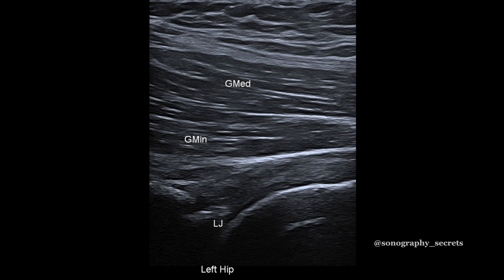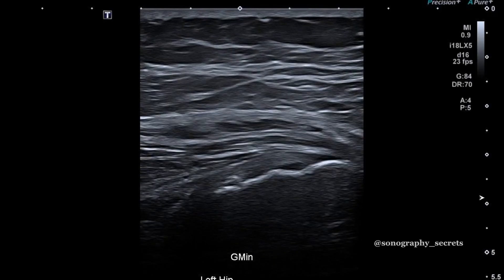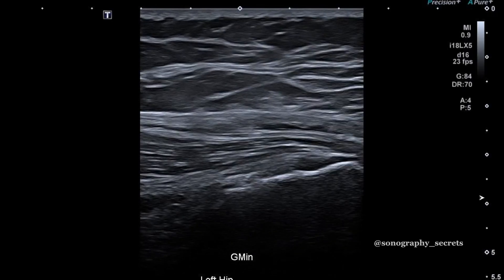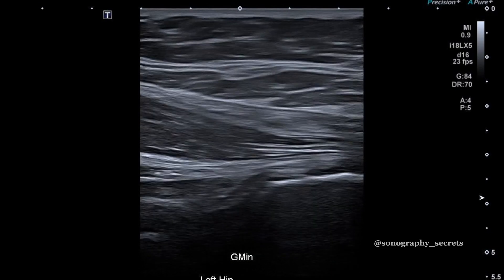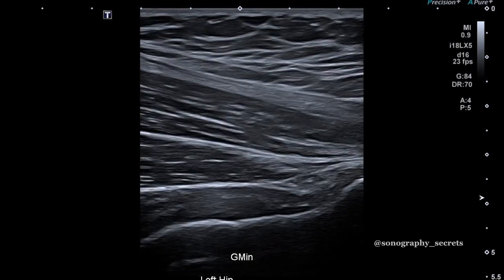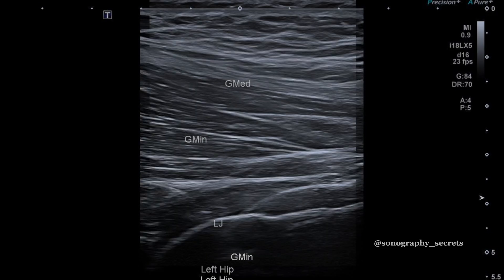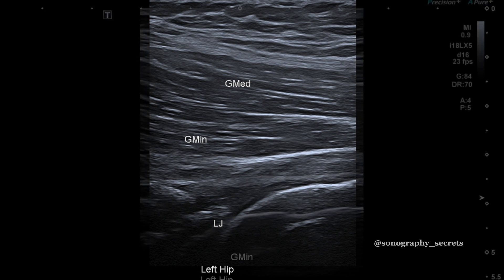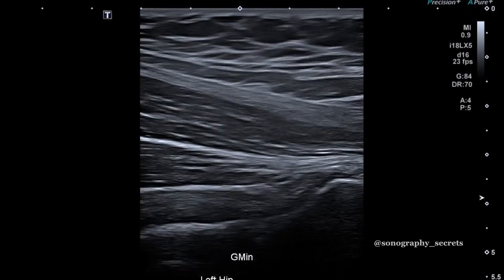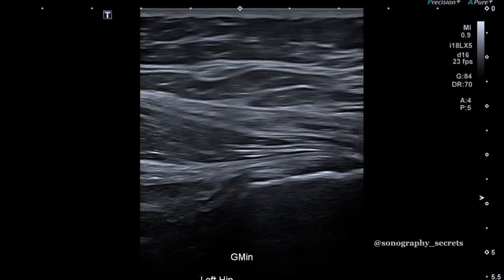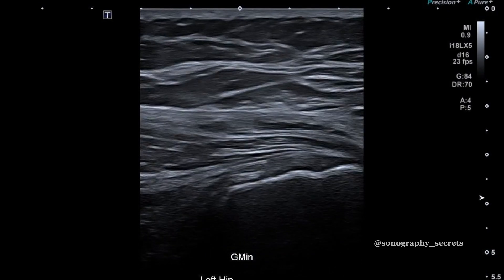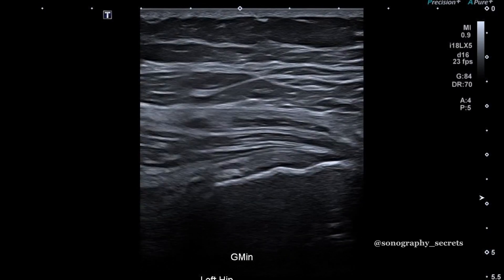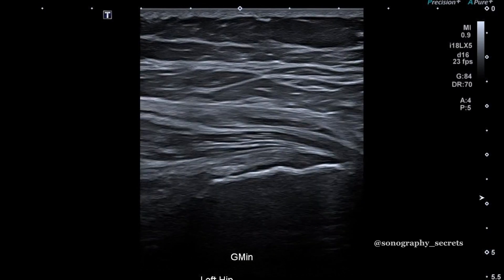The second method uses the muscle anatomy. With the heel of the probe on the greater trochanter and the toe of the probe pointing towards the pubic symphysis, we simply move forward toward the pubic symphysis. We drop our depth and here we can see the lateral aspect of the joint, the glute min muscle and the glute med muscle over the top. From here, it's just a matter of moving backwards, following the muscle back towards its tendon and to its insertion on the anterior aspect of the greater trochanter, for glute min.